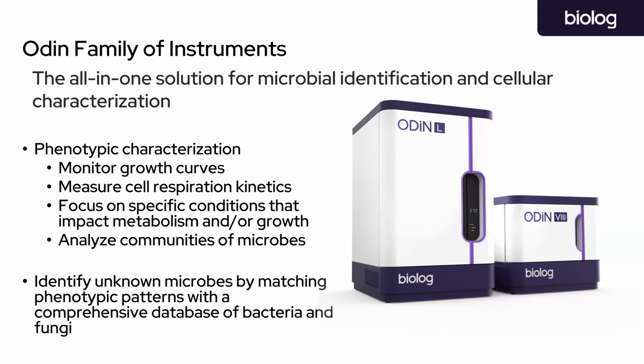And with these two orthogonal measurements, you can really quickly home in on specific conditions that either impact metabolism or growth or both. And something also nice about this technology is because you don't have to start with a pure culture, you can actually analyze phenotypes of a community of microbes. So, for example, how they might respond to different perturbations in their environment.